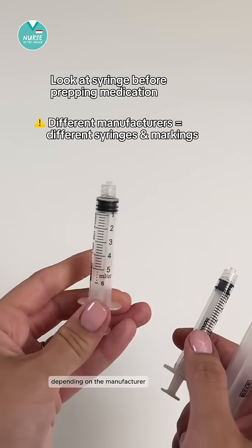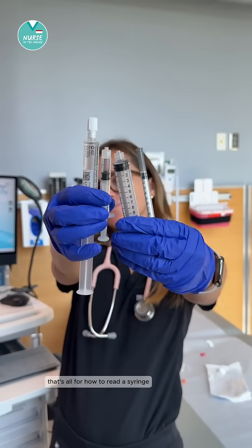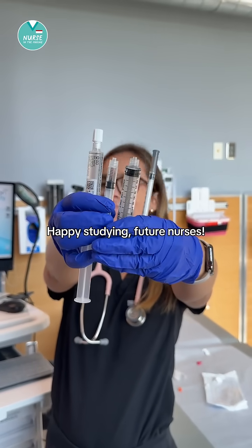You always want to take a look at the syringe before you prep your meds for administration. Depending on the manufacturer, many syringes can look different with different kinds of measurement markings. That's all for how to read a syringe — happy studying, future nurses!